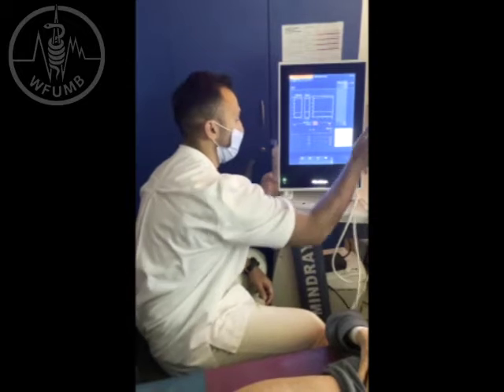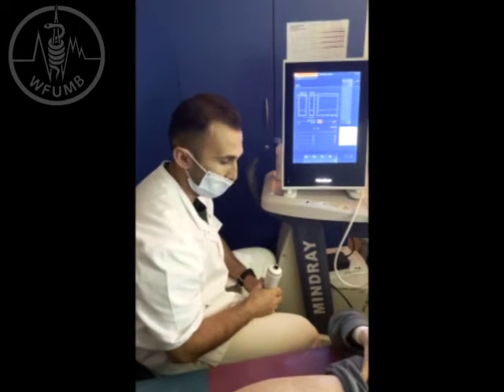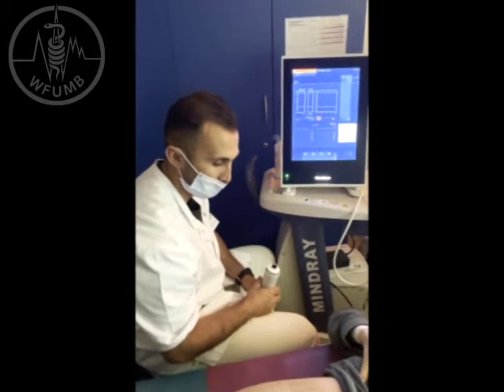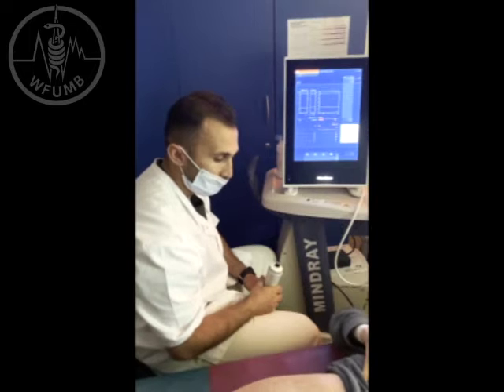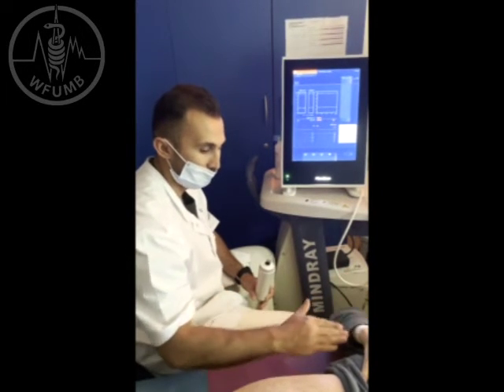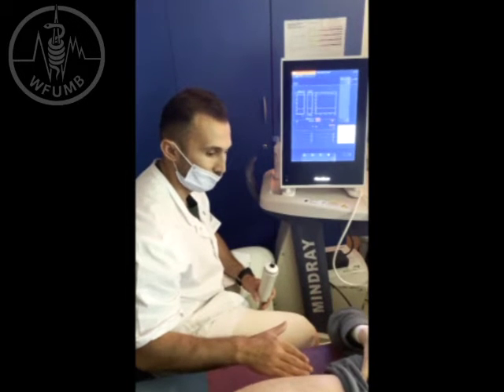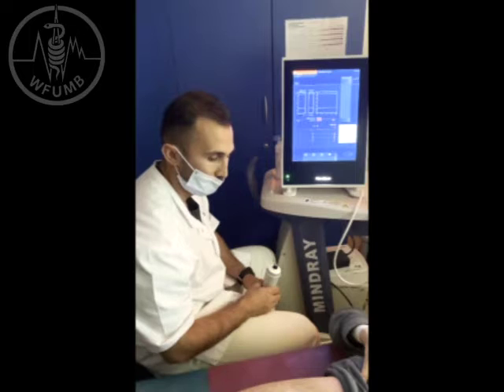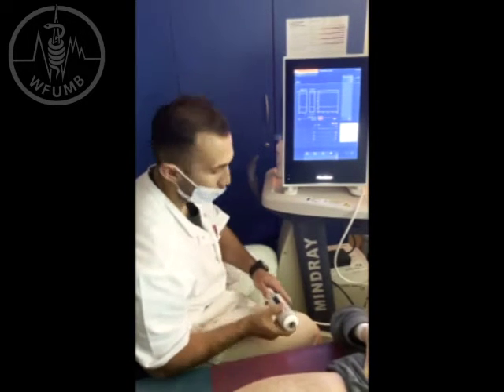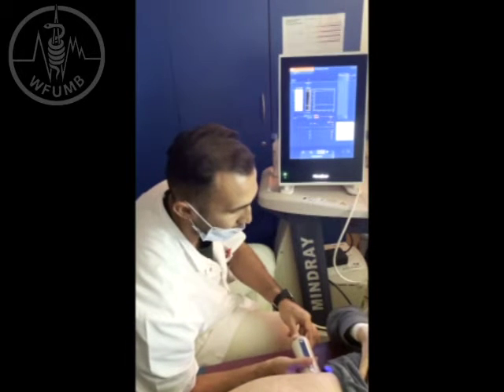First, we perform the examination by using as a guiding location an intercostal space in the mid-axillary line. We draw an imaginary line in the mid-axillary line and an oblique line by the sternum. We position the probe in an optimal location.